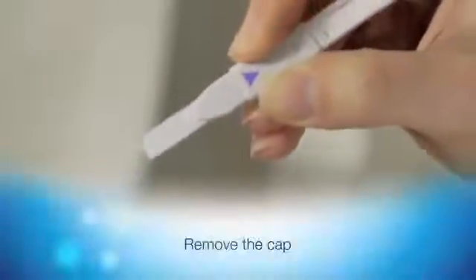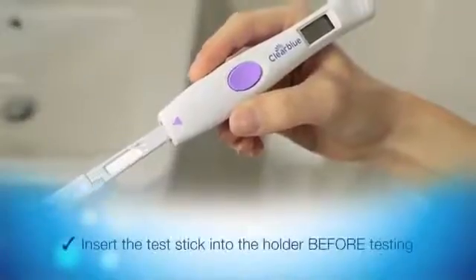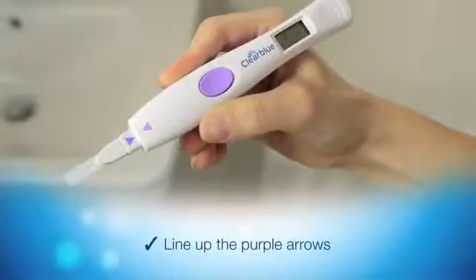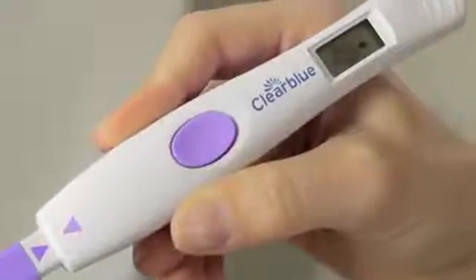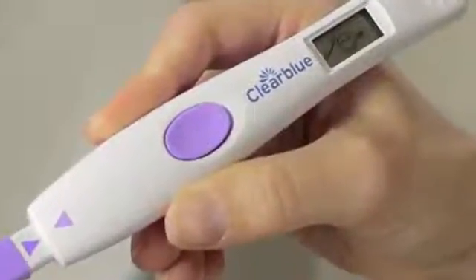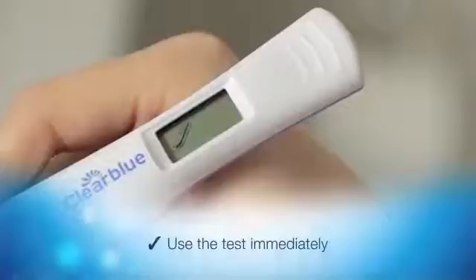First, remove the cap. Then insert the test stick into the holder by lining up the purple arrows. Push together until you hear a click. When you use the test for the first time in a cycle, the new cycle symbol will flash, then the test ready symbol appears.